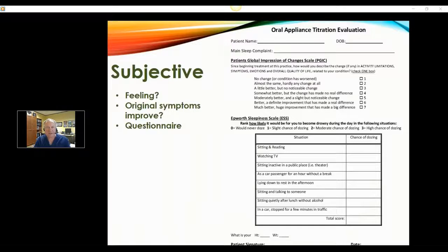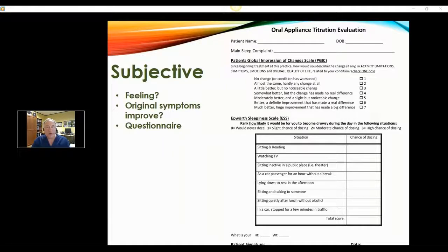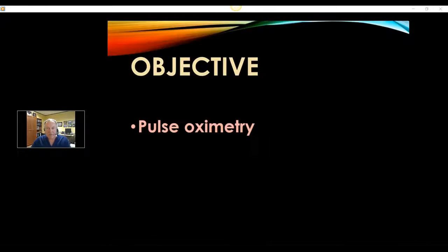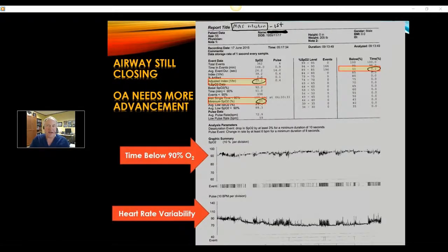The subjective findings I get by using the Patient's Global Impression of Change scale — they just mark off how they feel about the treatment so far. And the Epworth Sleepiness Scale is something we start from the very beginning and track. We want to be under 5 if we can. Now objective — that's where pulse oximetry comes in. This is a sample of a pulse oximetry I did on a mandibular advancement splint during their first titration. The patient had already started feeling pretty good, and we wanted to see where we're at.